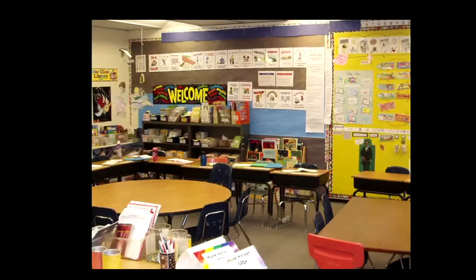So in this next picture, we have a typical 3rd grade classroom that has that incredibly dense, rich visual clutter going on. If you look along the walls, the student is having to access this information. How is your student going to do that? Being in that empty classroom and helping the student figure out the steps for doing this, where they can participate in the actual lesson.